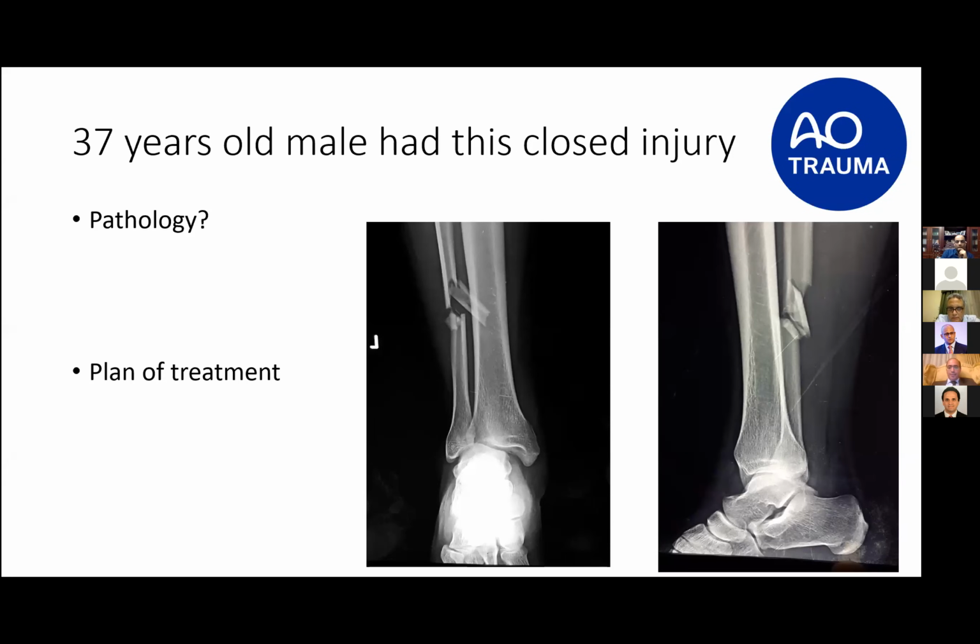Yeah. Okay. I think in this case we have to tackle the 3 injuries. I think the most challenging now is the fibular fracture. It needs to be properly restored and fixed in proper length.